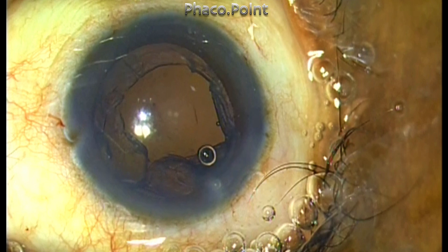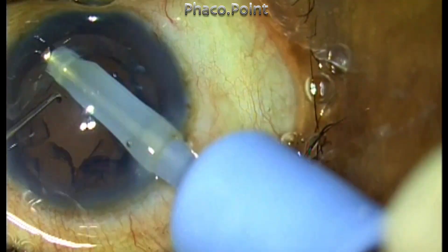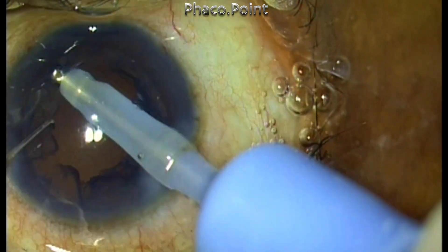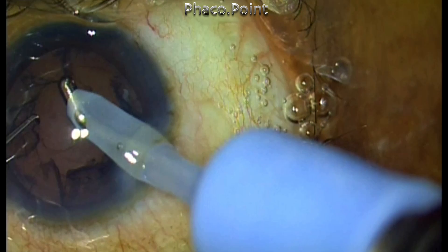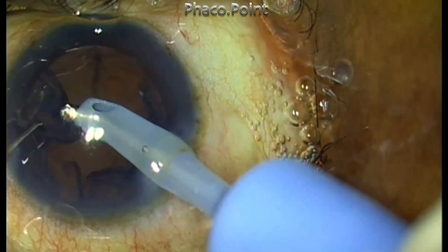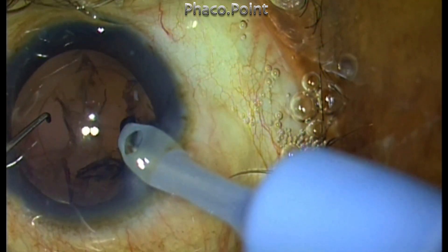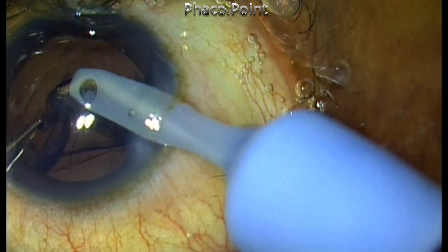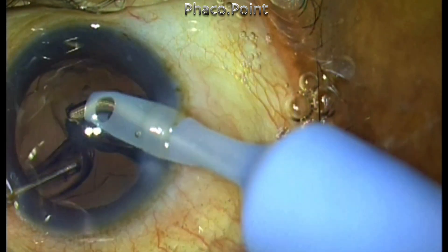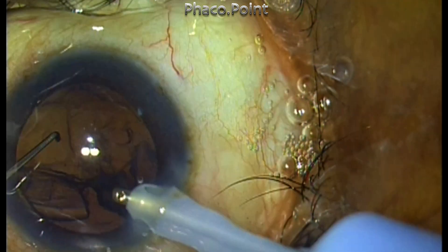To proceed from this point, first evacuate the cortex 180 degrees or diagonally opposite the site of zonular dialysis. The surrounding zonules are strong and healthy and will not get compromised. In the sub-incisional area, the capsular bag presents itself, so it is very important that you do not persist in removing the sub-incisional cortex.